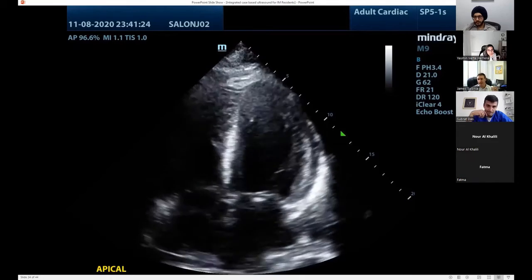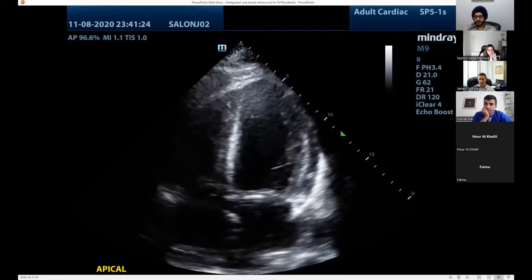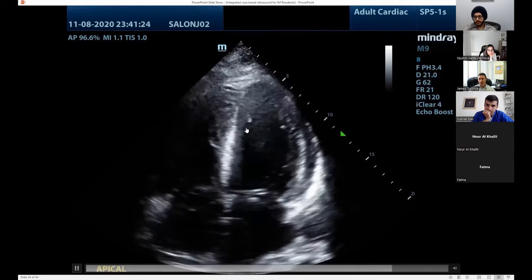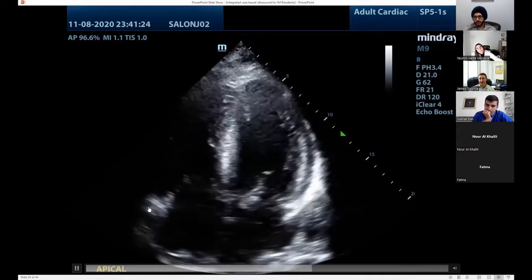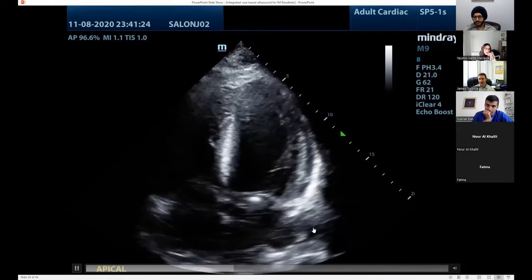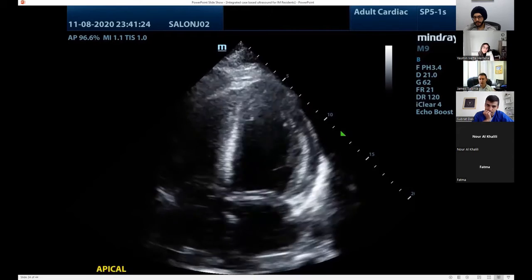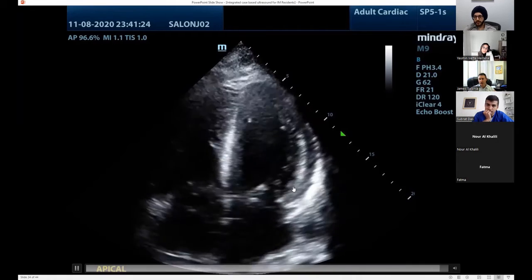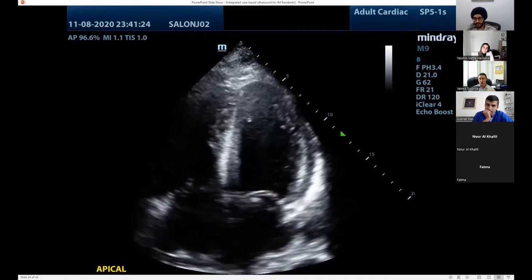Good. So if you can't see it, you can't fully comment on it, which is important with any image you have. But I agree with you. It looks like here we don't have good myocardial thickness or endomyocardial excursion. Another thing, I know you guys are all waiting for it, TAPSE on the right side, but we also have its cousin MAPSE on the left side. So the mitral annulus plane systolic excursion. There is some longitudinal movement to the LV. You can put M mode over this annulus, the lateral annulus, and you can actually assess it. Anything less than 1.1 centimeters is abnormal.